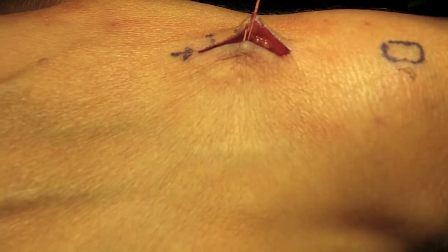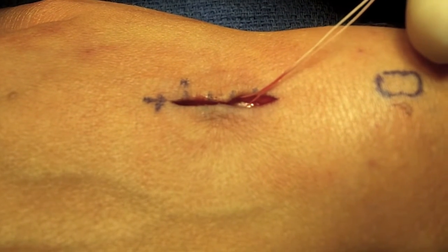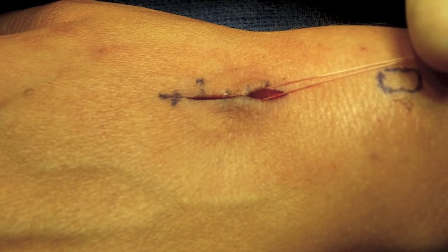I start by putting some sutures in the subcutaneous fat layer. These are critical sutures that hold most of the tension of the repair and prevent the wound from spreading apart. I want the incision to come almost all the way together after I put these in.